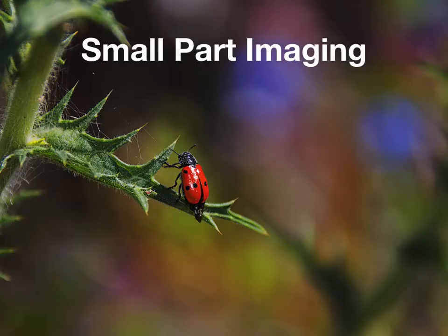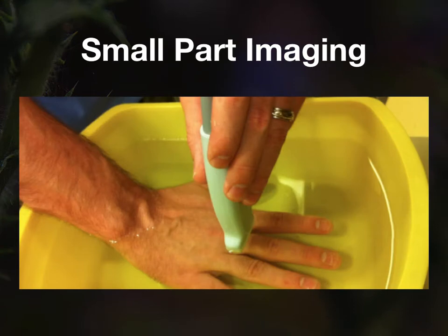While the majority of soft tissue and MSK injuries are amenable to direct pressure with the ultrasound probe, small parts such as finger tendons and joints are often difficult to assess with direct placement of the ultrasound probe on the skin, given the superficial nature of the structures of interest and even patient discomfort. The water bath will be your best friend here and will allow for excellent visualization of your anatomy as well as less pain for the patient. You may also try a plentiful quantity of gel, however this can get messy.